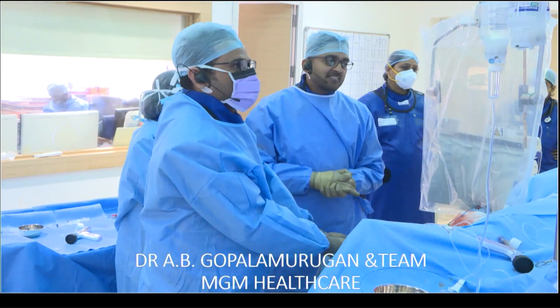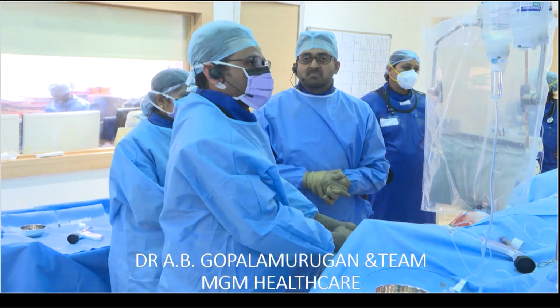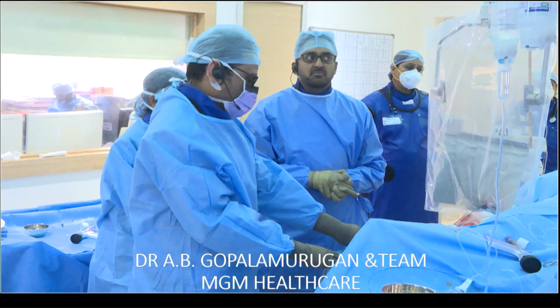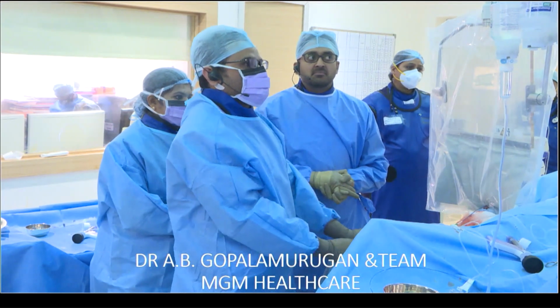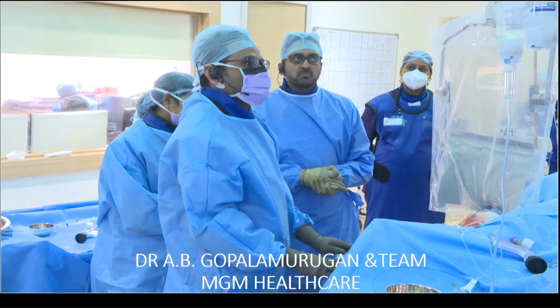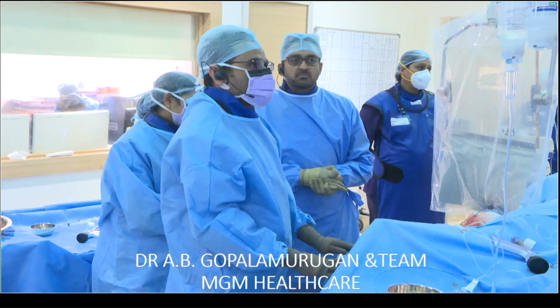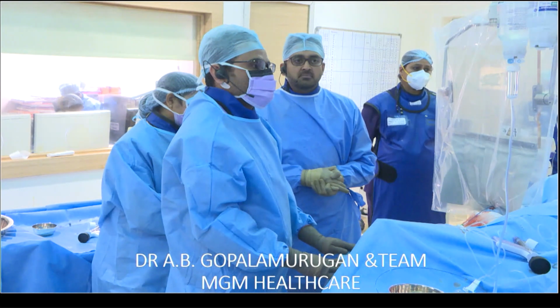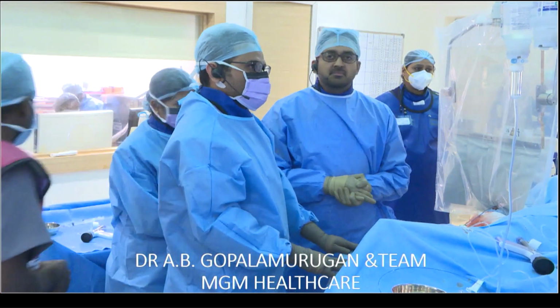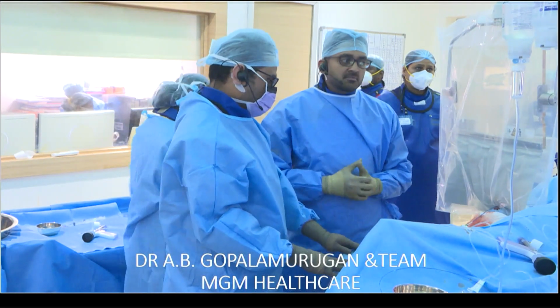I think that's a very interesting comment, and in fact, it's for the audience, it's very, very vital that the two indeflators should be in a duet. It should absolutely be very consonantly done. Otherwise, things can happen like that. And wonderfully recognized. And of course, you are a master. You're looking for precision for the final result because it is a DAP dependency HBR scenario, and you wanted the best optimal result.